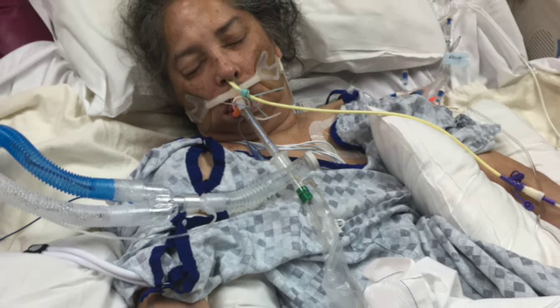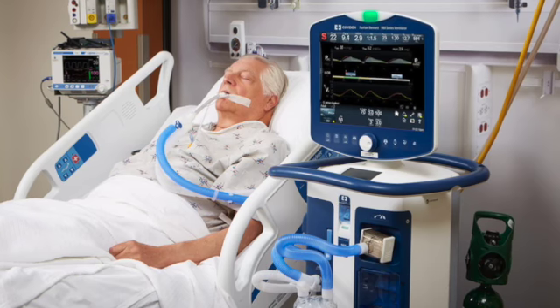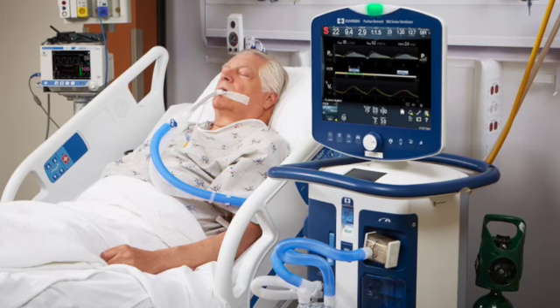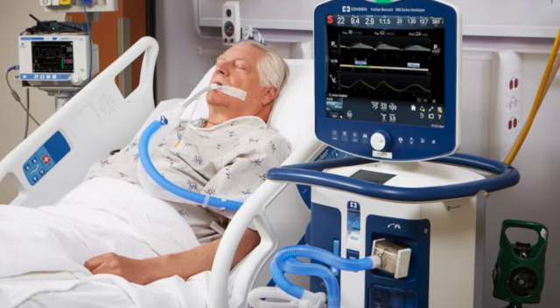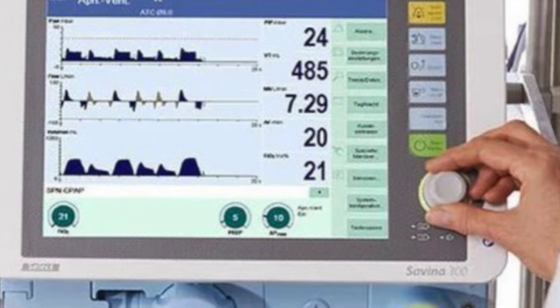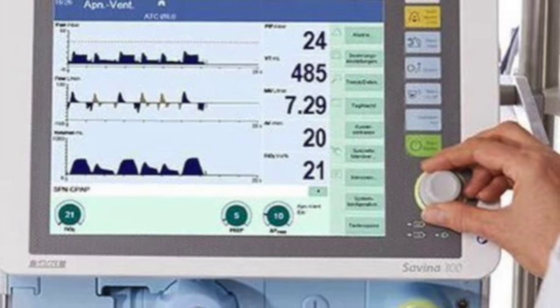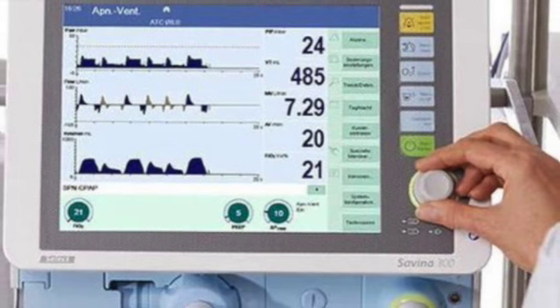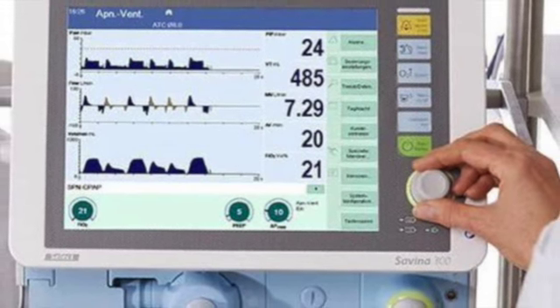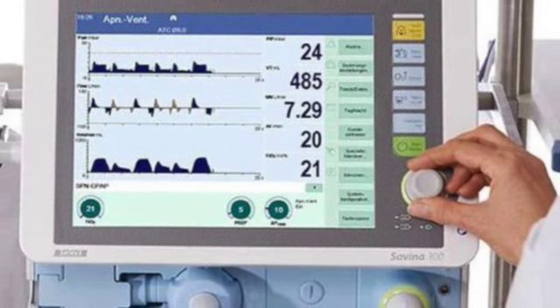Then we see a microprocessor ventilator. This is a computer-managed positive pressure ventilator, and it often uses all three components: the volume, time, and pressure. This type is more responsive for patients who have severe lung disease. So these all look similar, either with the mask or the patient intubated with the tube, but the way it's delivered, the type, is what is different.